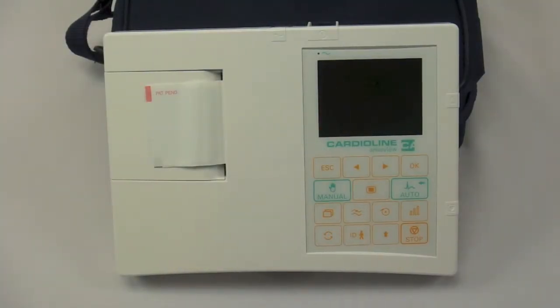CardioLine U.S. is proud to introduce the newly redesigned CardioLine AR600 series. This 12-channel EKG is available in three configurations.